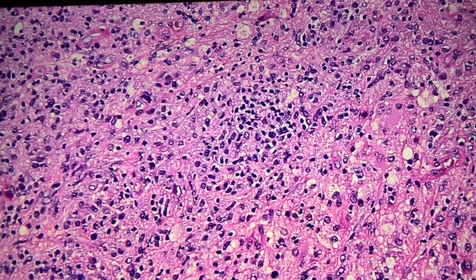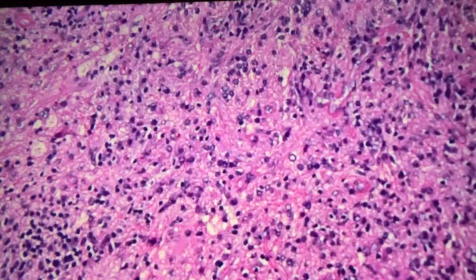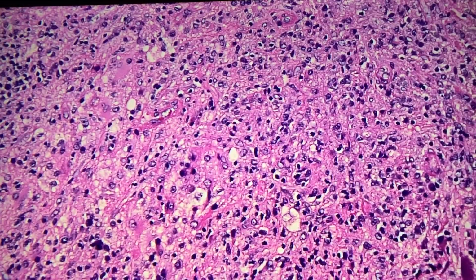So do you think this is an inflammatory lesion, or do you think this is neoplastic? I'm leaning neoplastic at the moment, partly because this is an unknown session. But this could well be inflammatory, with reactive atypia is still in my differential. Alright, Aaron, there's a clue in this field. There's a clue to a very specific diagnosis in this field. Very specific.